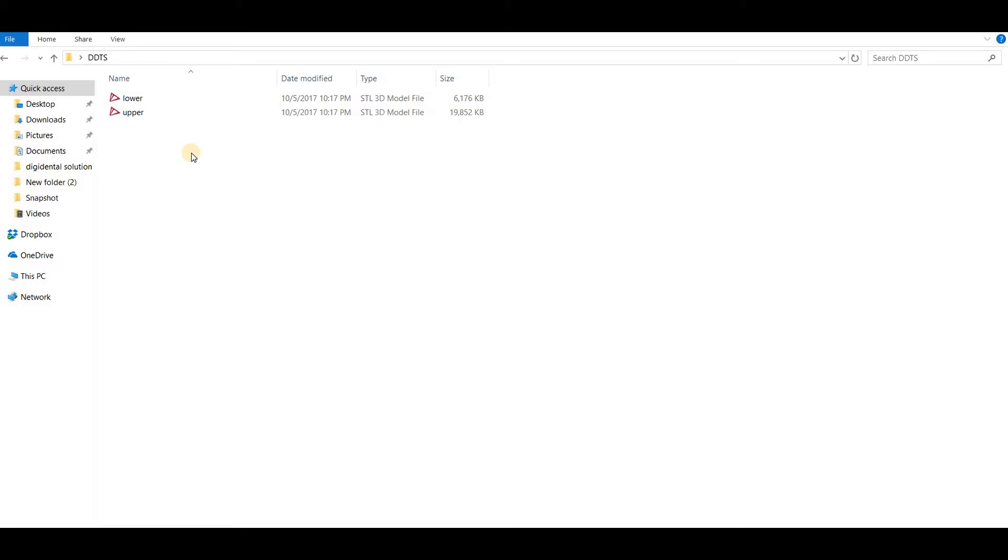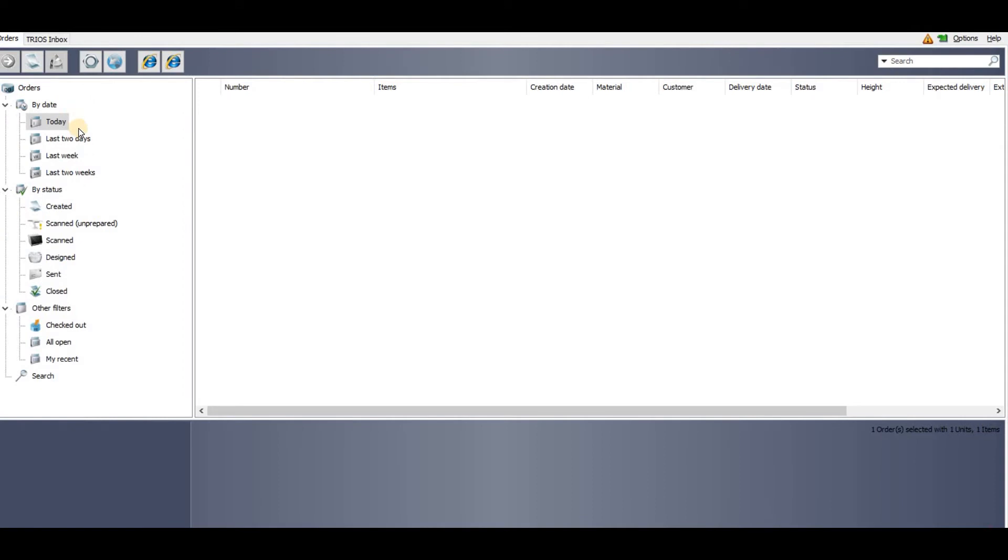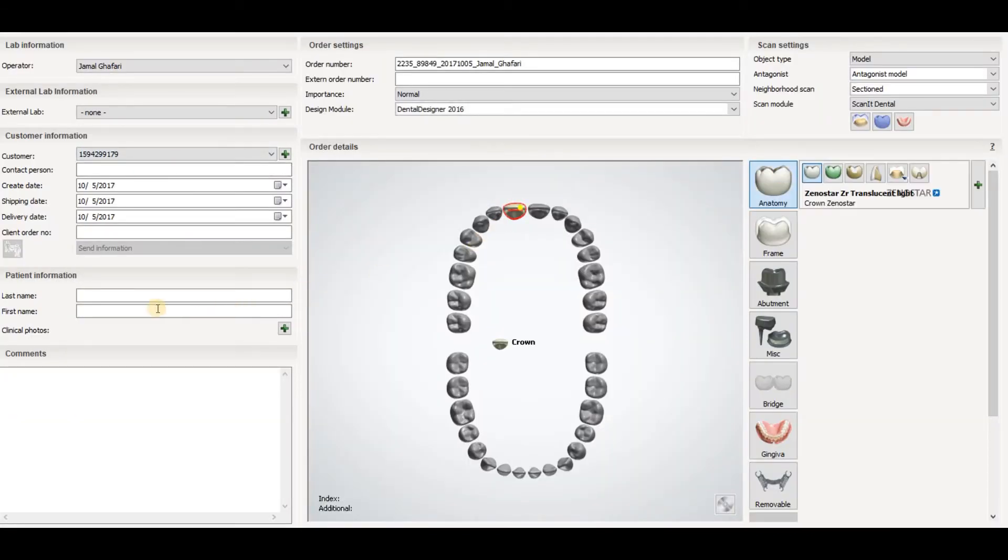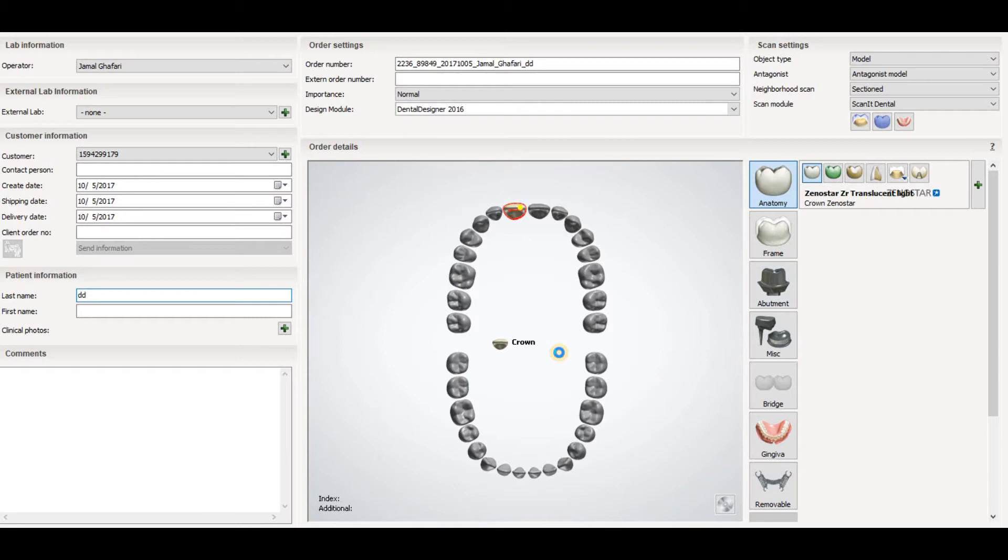Using the 3Shape dental system, just create a new order, select any tooth. You can choose anything, then press OK.